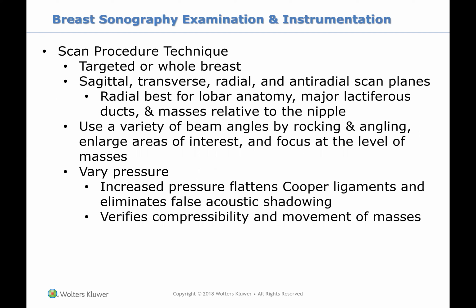So there's different kinds of techniques. You could do a whole breast. A patient is just having breast pain, a younger patient, and you'll scan through the whole breast to see if you see anything. And I take another image every couple of centimeters.